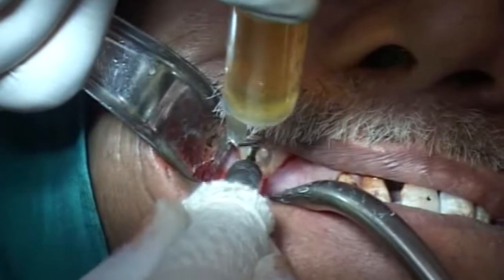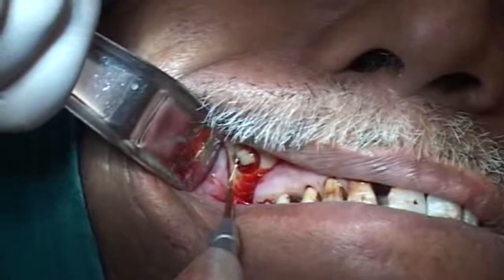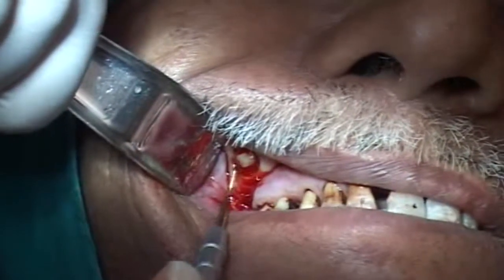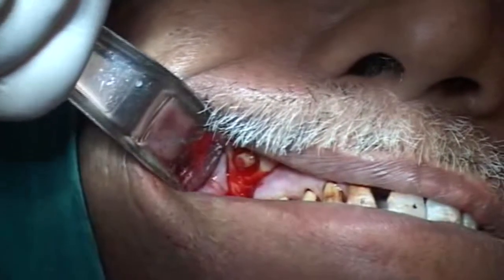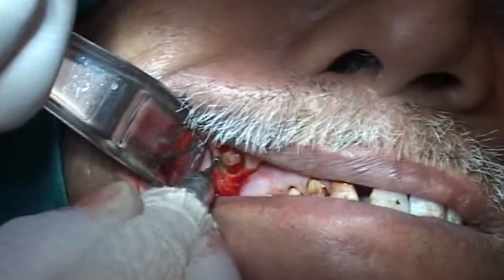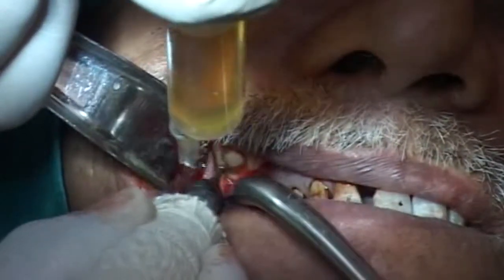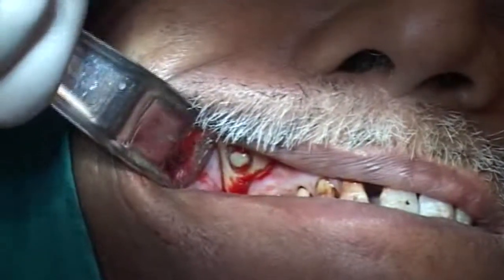We check the perforation not by any sharp instrument but by an instrument like an excavator. Once we have approximately separated the bone, we just push the window and fracture that thin margin. Here on the distal area the bone is still intact, and that bone piece cannot be moved, so we need to cut further bone here.